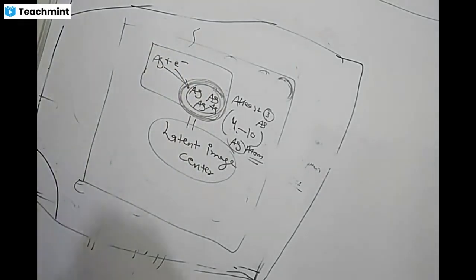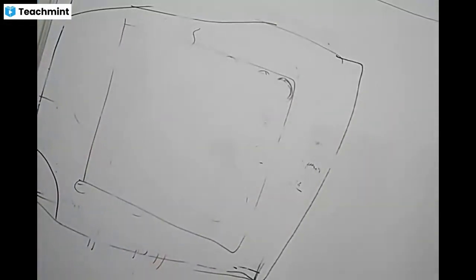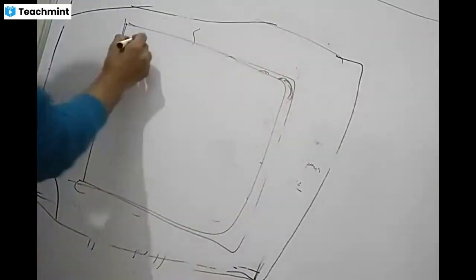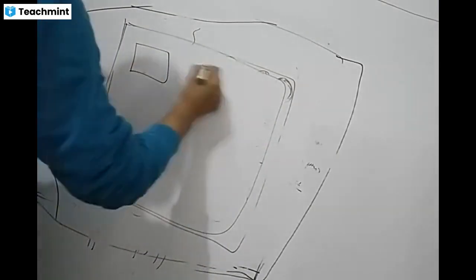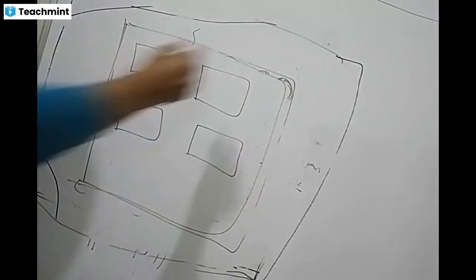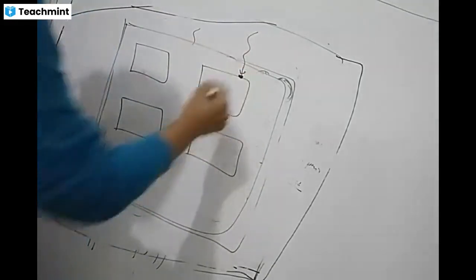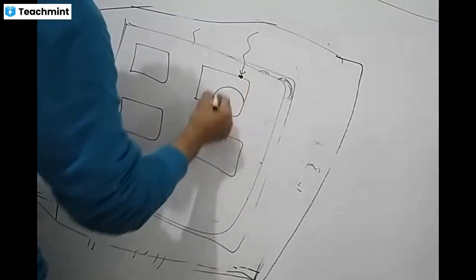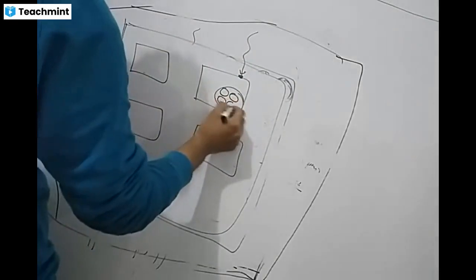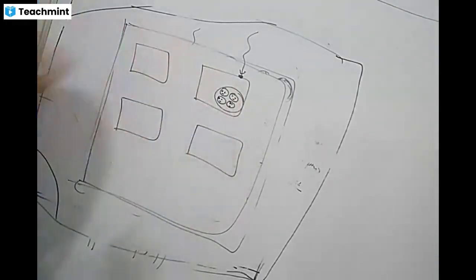If we look at these crystals in the emulsion, it will look like this. This is the complete emulsion layer, and these are 4 crystals. The photon comes, it breaks the bromide, electrons come out, and here in the sensitivity center, suppose 1, 2, 3, 4 atoms are reduced.